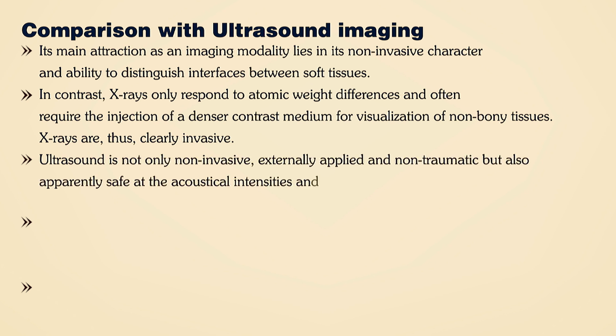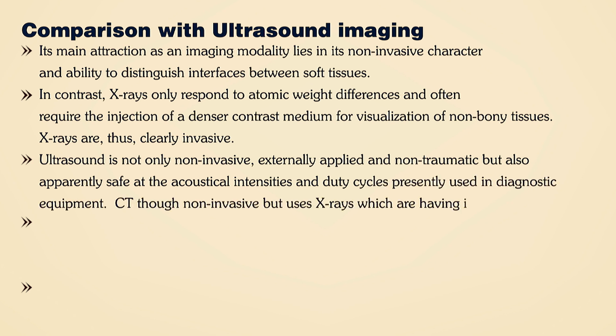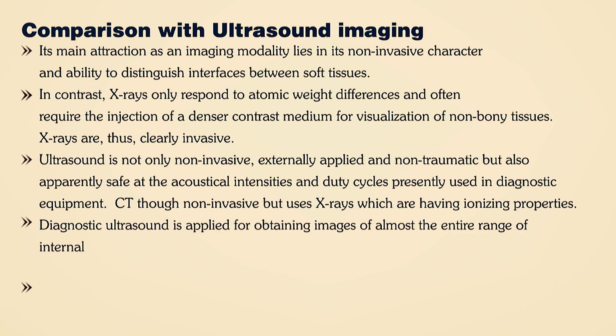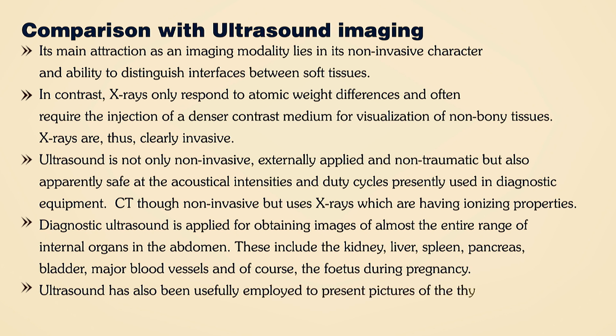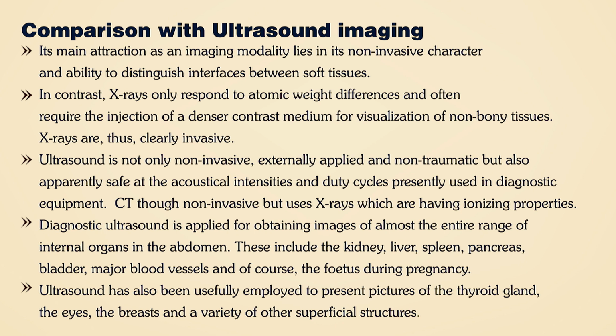Ultrasound is not only non-invasive, externally applied and non-traumatic, but also apparently safe at the acoustical intensities and duty cycles presently used in diagnostic equipment. CT, though non-invasive, uses X-rays which have ionizing properties.